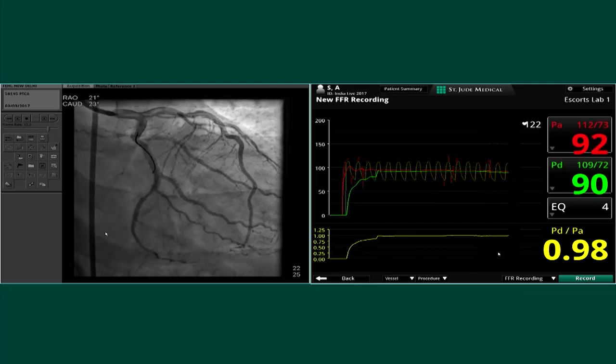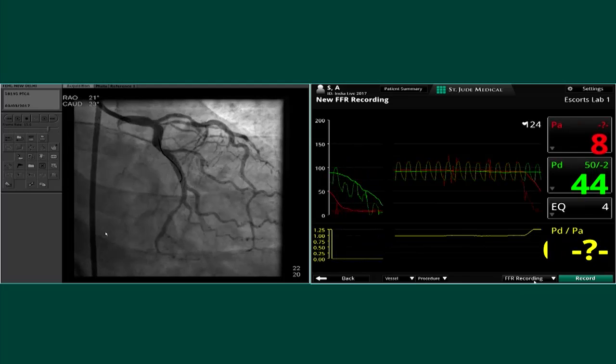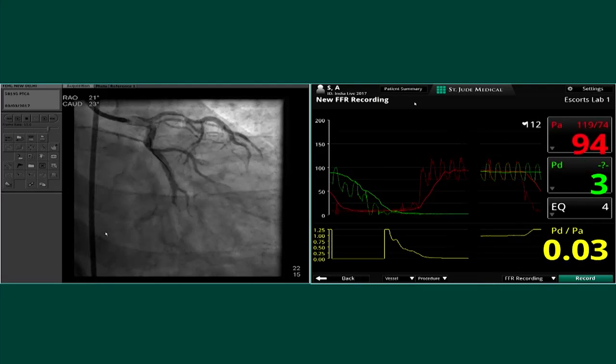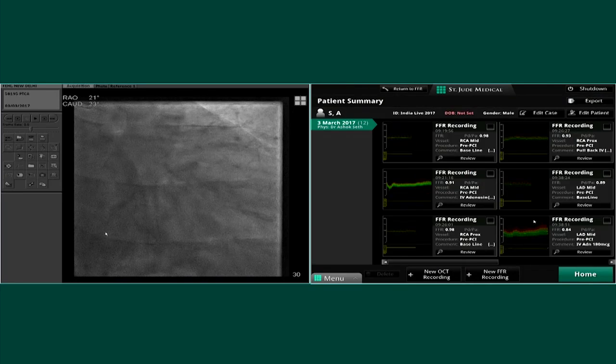Okay, so here's our plan. I'm puzzled by this, but the lesion to me, circumflex, looks tight. He's got soft lesions. I'd rather stent the circumflex, had a 10 millimeter gradient there.